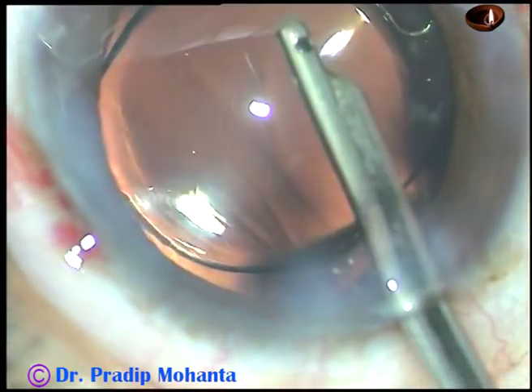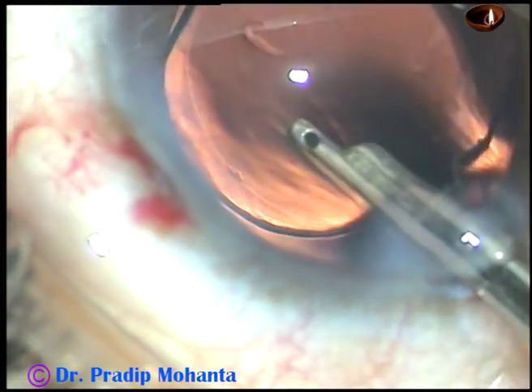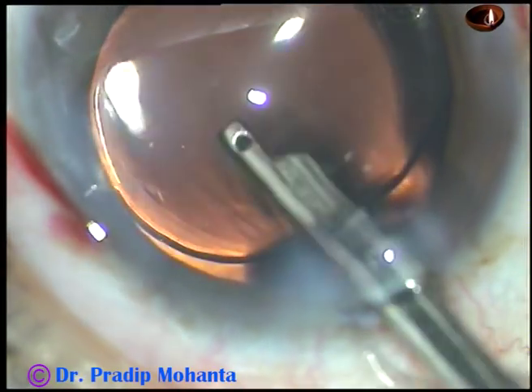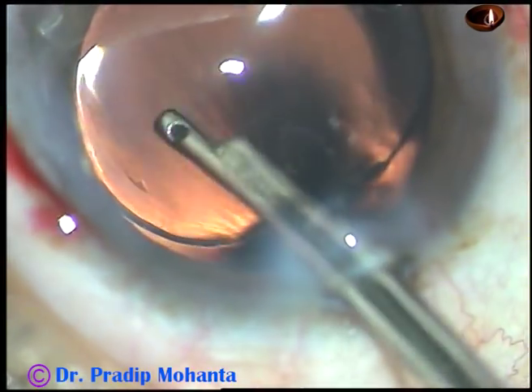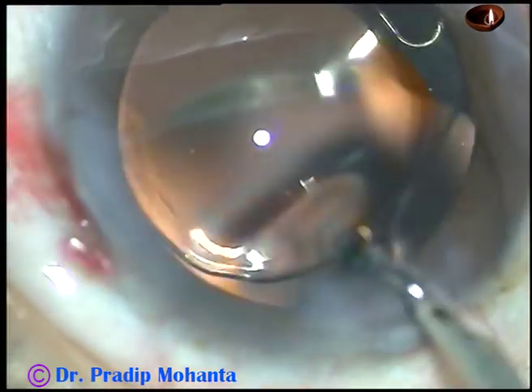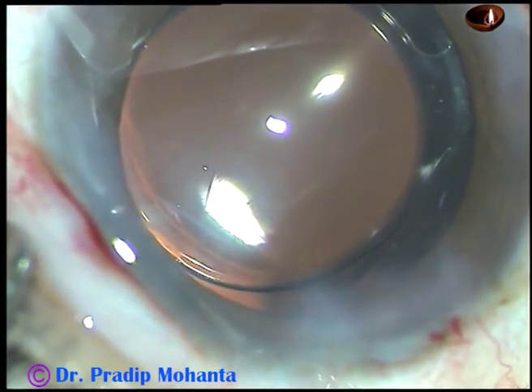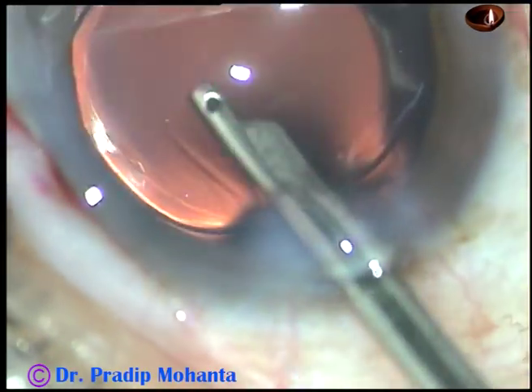Introduce the 23 gauge Simcoe and direct some BSS towards the corneal endothelium through the aspirating port by flushing out some BSS. And you could see that lot of visco that stuck to the corneal endothelium got dislodged and came out. That's it. This is a nice way, and this is done very gently, and it never causes any corneal endothelial cell damage.